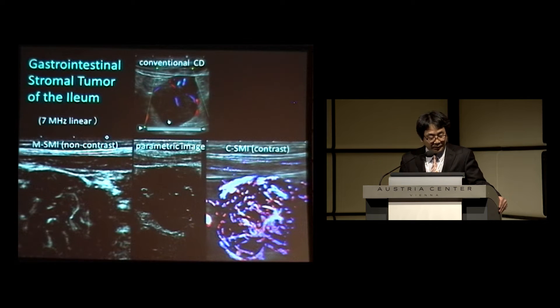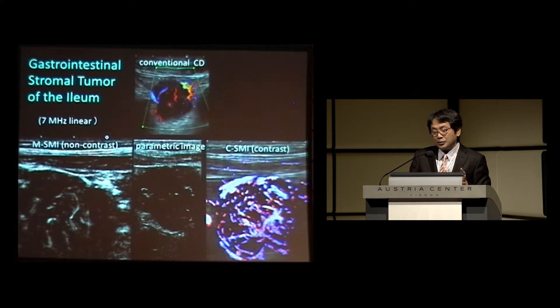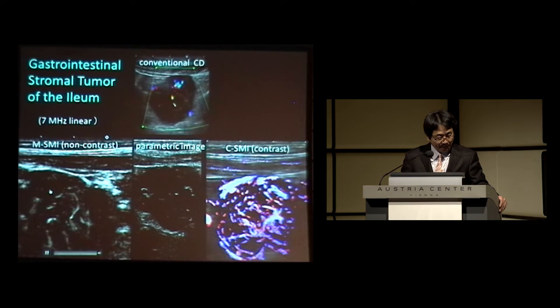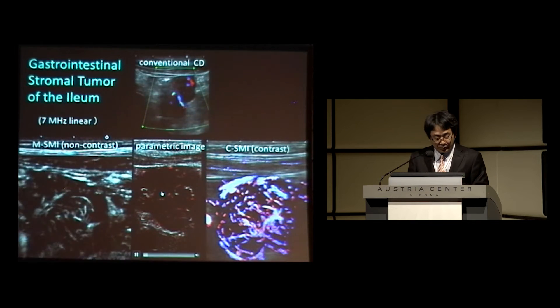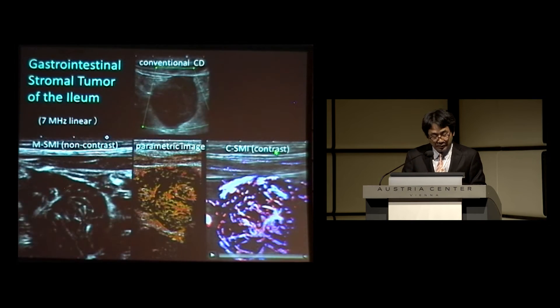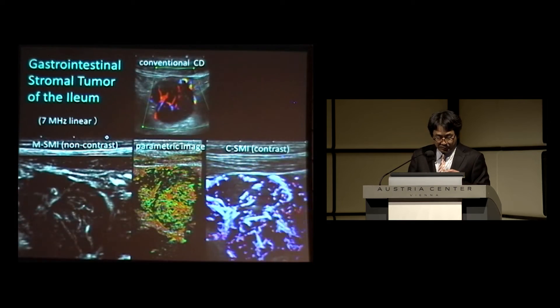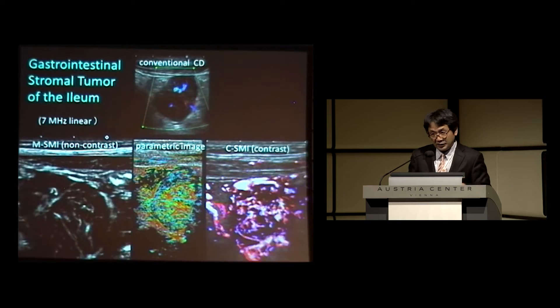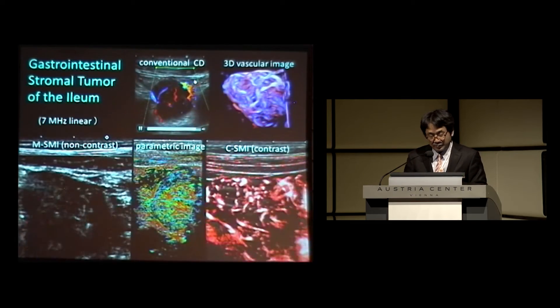We now have several options to investigate tumor vessels. Using conventional color Doppler, you can see tumor vessels with relatively higher velocity and larger caliber, with information on flow direction. SMI reveals more and more of the tumor vessels inside. If you want to know the perfusion of the tumor, you can use contrast ultrasound. And even after contrast ultrasound, you can go back to SMI to see live images of fine vessel structures, as SMI becomes extremely sensitive after contrast agent injection. You can also create a 3D vascular image showing that this tumor is very hypervascular.